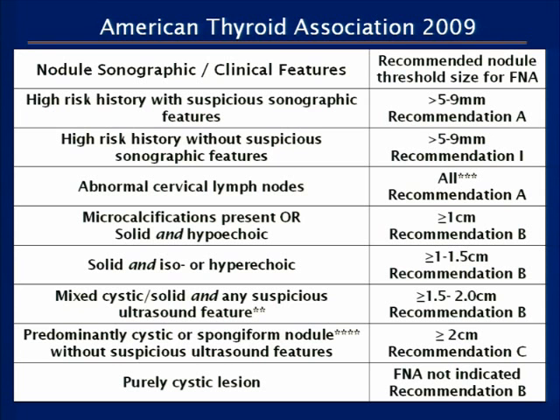So in the guidelines, what they've put together is this chart which combines, 1, the sonographic features, 2, the size of the nodule, and then 3, issues of high-risk history. So things that are high-risk history are people who were exposed to radiation as a child, people with strong family histories of thyroid cancer. So when you have a patient who does have certain background risk factors, you may consider a biopsy of a nodule that might be smaller than someone who doesn't otherwise have those risk factors. So if we just look at this, you'll see high risk features as well as suspicious sonographic findings, microcalcifications, hypervascularity, even a teeny tiny nodule, 5 to 9 millimeters, you might want to consider doing a biopsy. I would not standardly do a biopsy on a small nodule like that, but really when it looks very suspicious or the patient has a really concerning history, it's certainly something to consider.